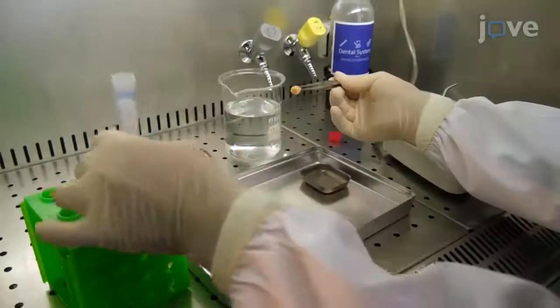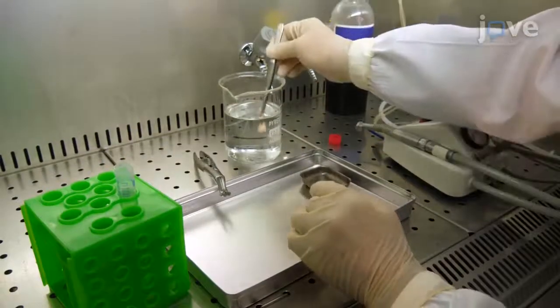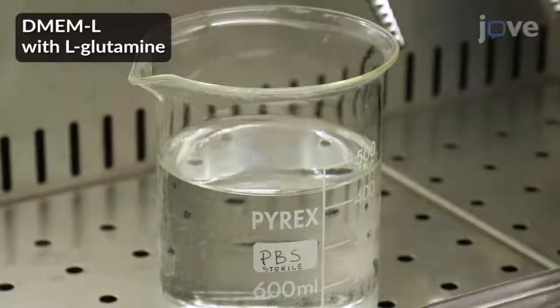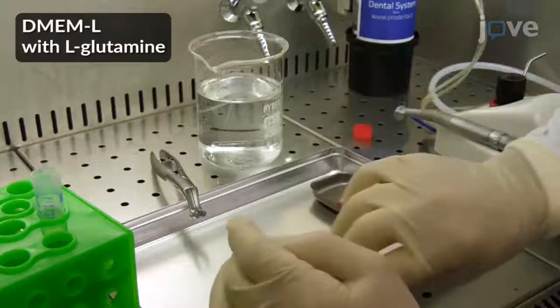To begin, extract the third molar from the patient, quickly rinse it with PBS, put it in the 15 milliliter test tube with the medium, and transfer it to the laboratory in less than two hours.